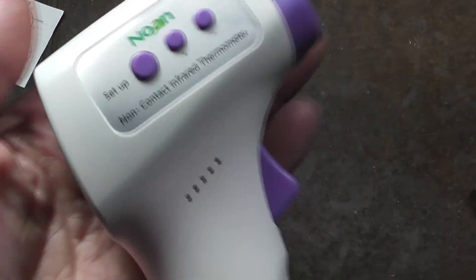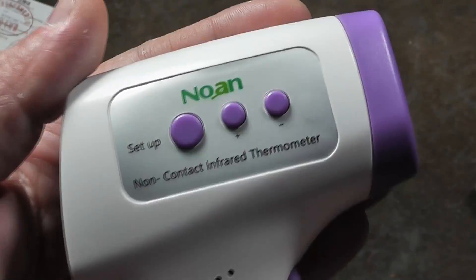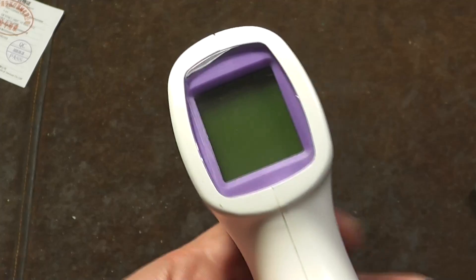It's Maximus here. I'm just doing a quick video. This happens to be kind of like a no-name. This is a medical body temperature heat gun.